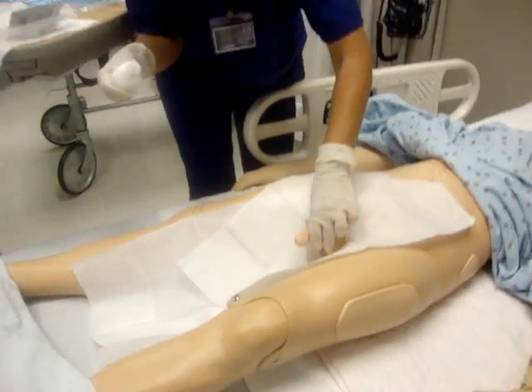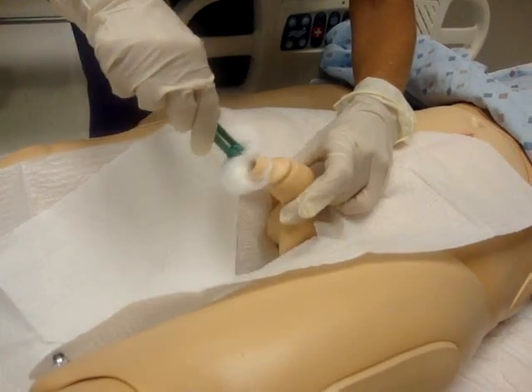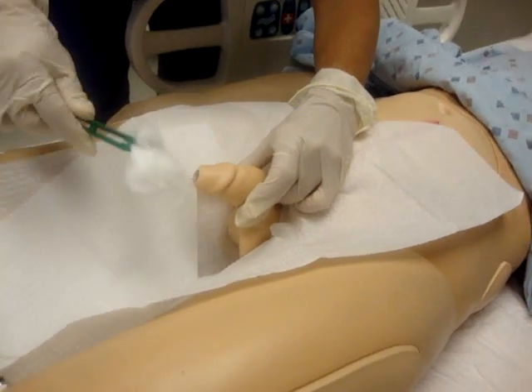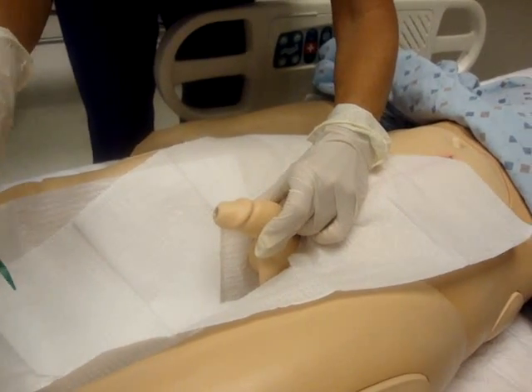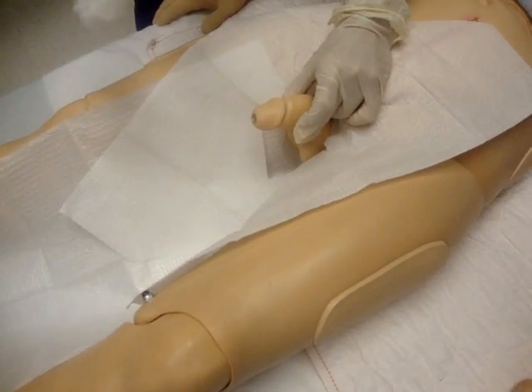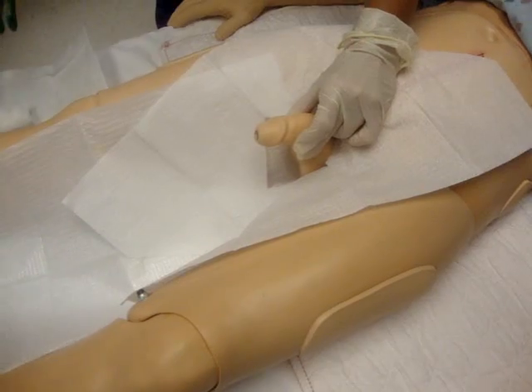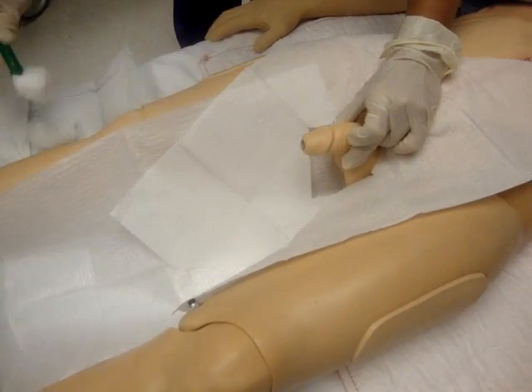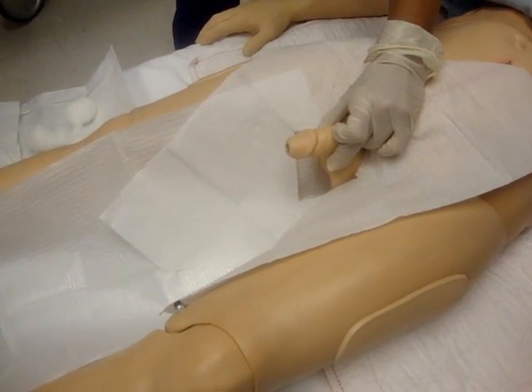If you know you just contaminated, stop and change your gloves. But the rest of it's still okay — just your gloves were contaminated. So then we grab the penis, hold it up, and start in the center — concentric circles. You've got a whole bunch of cotton; drop it here. Now you've just taken that dirty cotton ball and thrown it on your sterile drape — somewhere else, in a trash or somewhere else, would be better. A lot of times people will open their gloves and just throw their trash on the glove wrapper. Grab another one — center, around the edge, and drop. Center, around the edge, and drop.